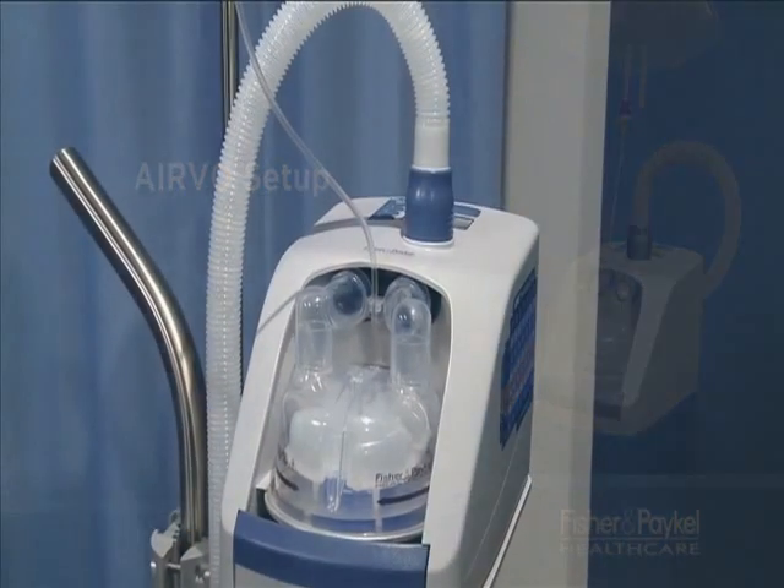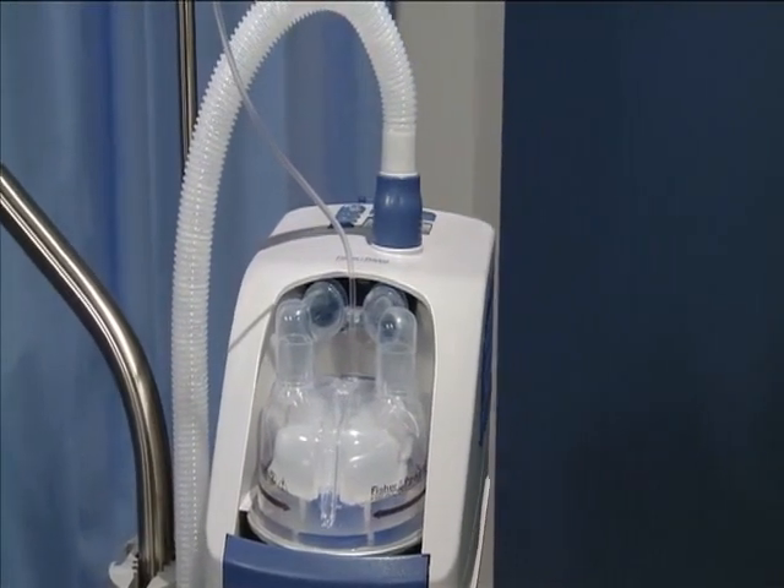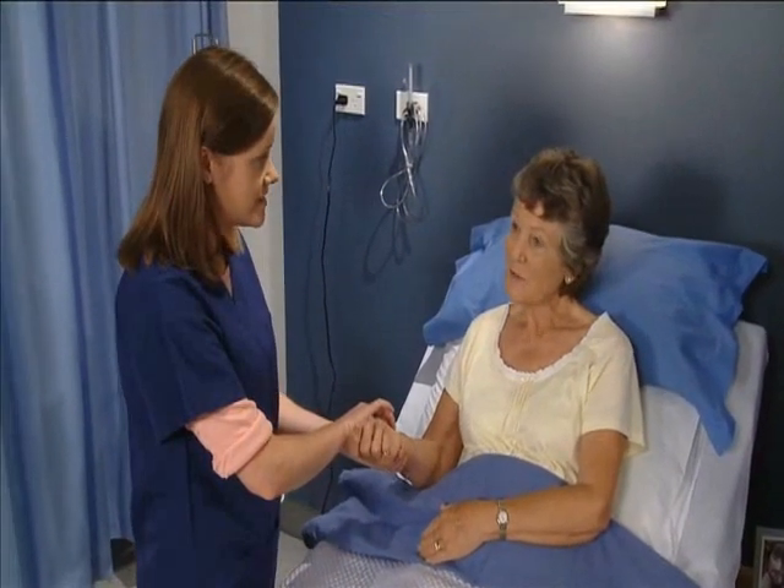Now we are going to look at setting up the AIRVO for a patient who requires high flow therapy. Supplementary oxygen will be covered in the next chapter.